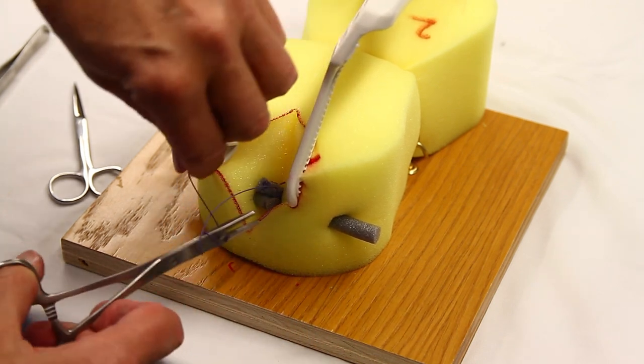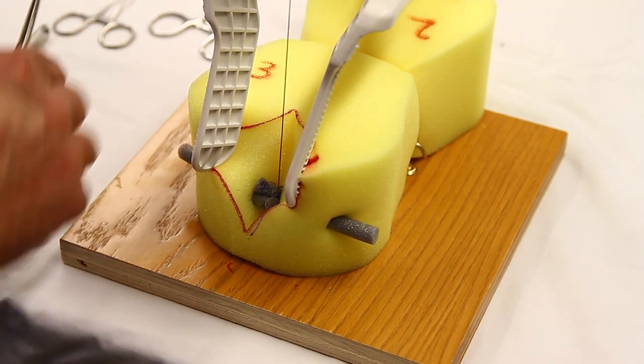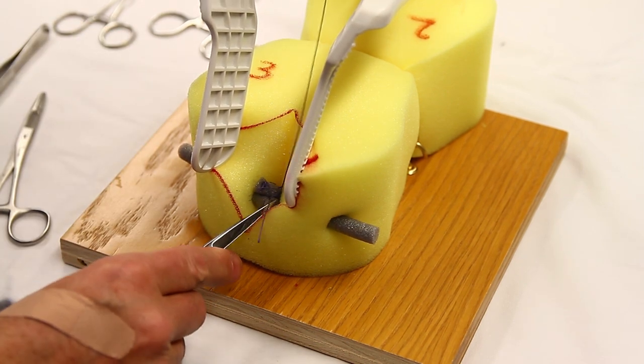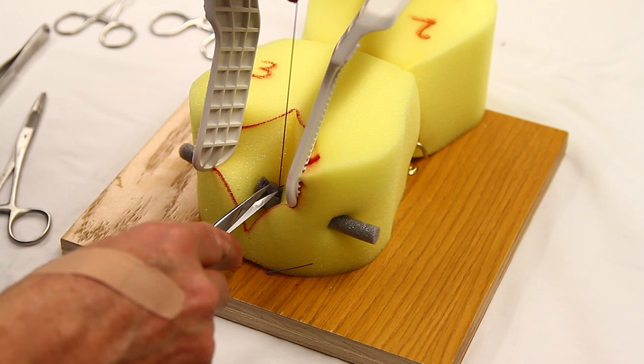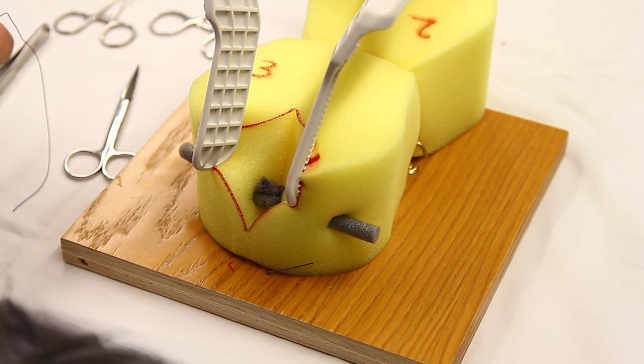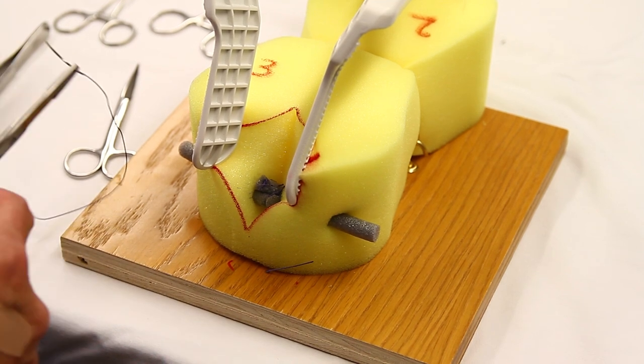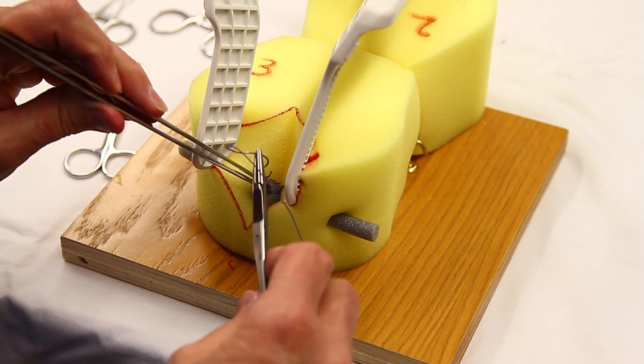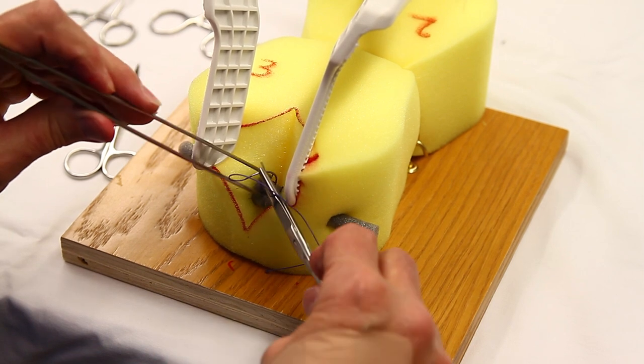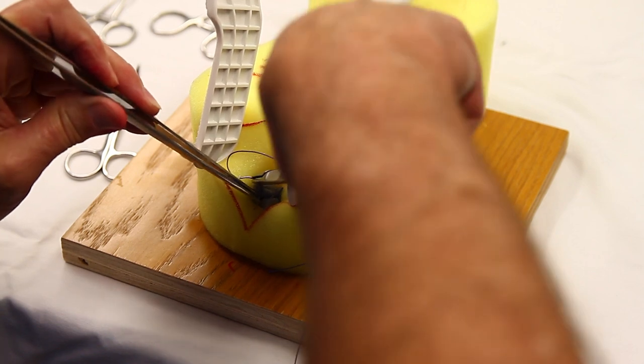Three knots, one of them being a double knot. And then the third one we can place between the other two. This is usually the easiest one because things are pretty stable by now.